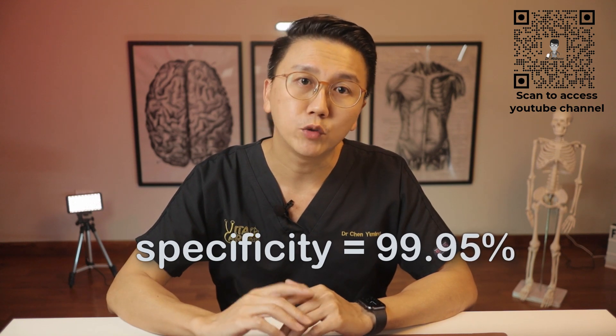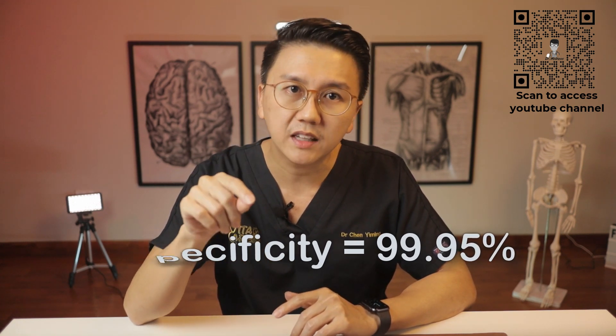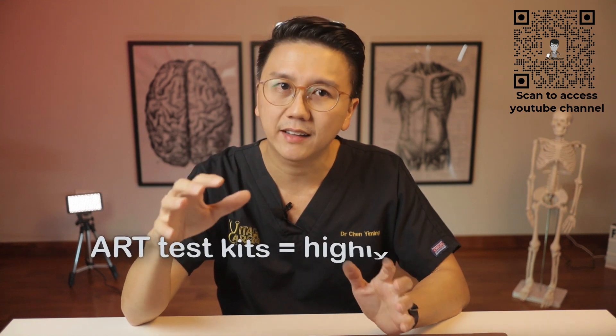These kits have a specificity of about 99.95%, which means to say that if you are tested positive on one of these kits, the chance that the results may be wrong is only about 0.05%. So they are highly accurate test kits.